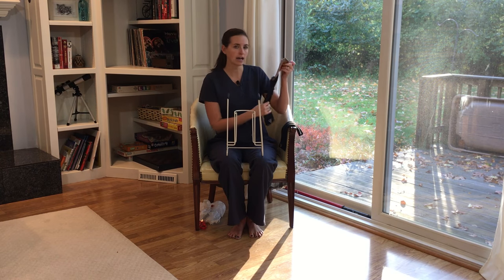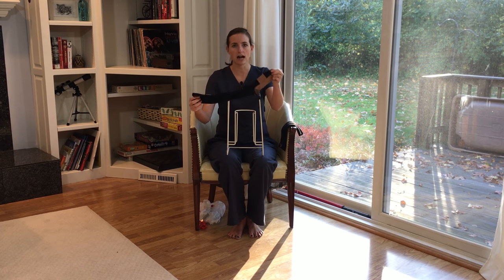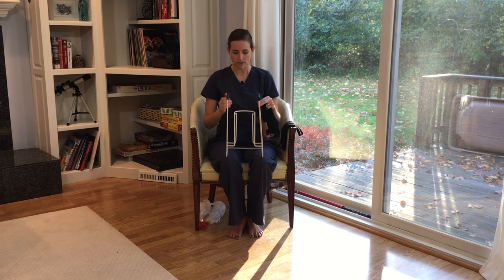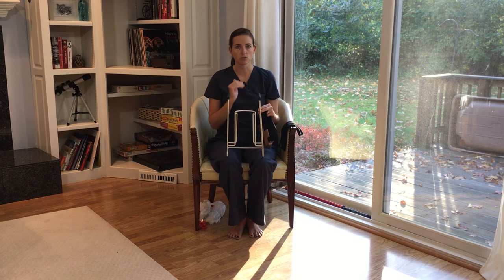So I have a set of compression stockings here. These are a low compression over-the-counter stocking, so they're going to be in the 20 to 30 range as far as compression is concerned — not the most difficult to get on, but this can make life a lot easier. The important thing is how you orient the tool. You want this little U-shaped piece here to be open facing away from you, just like a sock aid would be, so this part comes towards you and you've got your handles here.